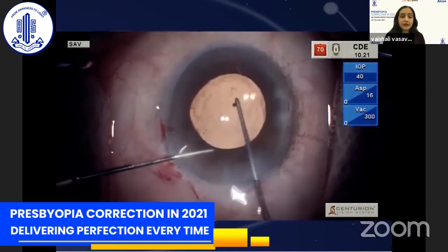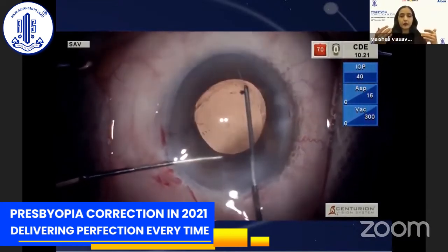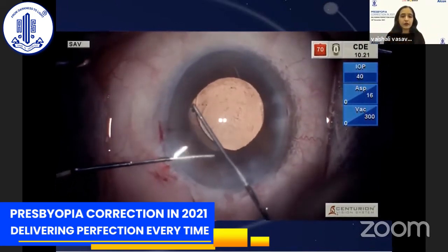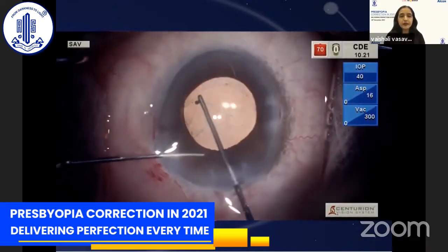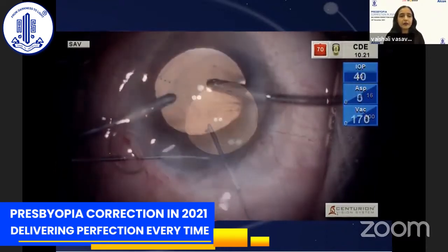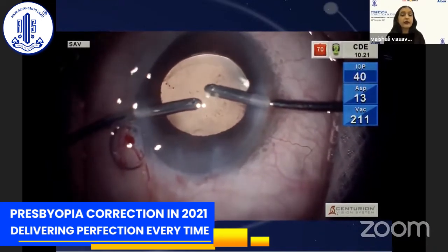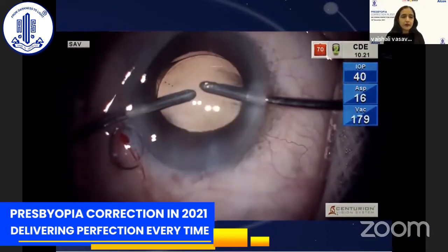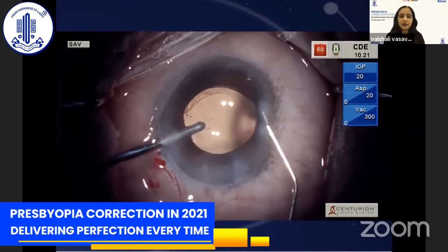The only catch, yes, there would be, and it's a valid discussion, that there might be a tilt on the IOL, and with the asphericity and toricity in place, what would happen to the refractive or the visual outcome. But from our practical experience with this platform, because of its tackiness, and if you maintain the chamber well till the end of the surgery, typically it will not be so much of a clinical compromise. Yes, if you were to check the aberrations, maybe there will be some change, but practically speaking, it really doesn't bother. Always hydrate the incisions before you come back.